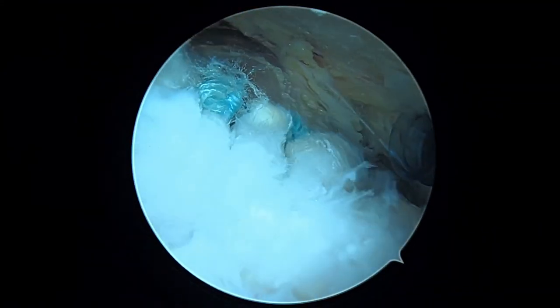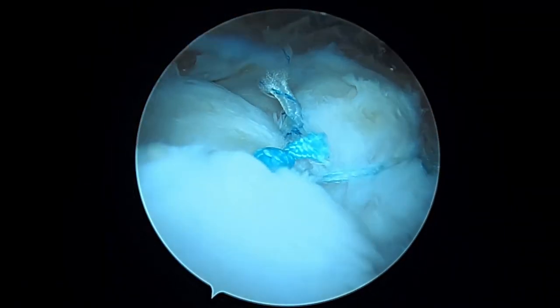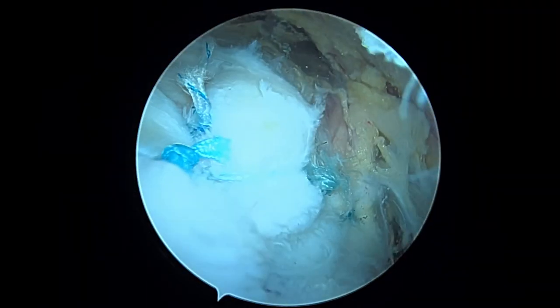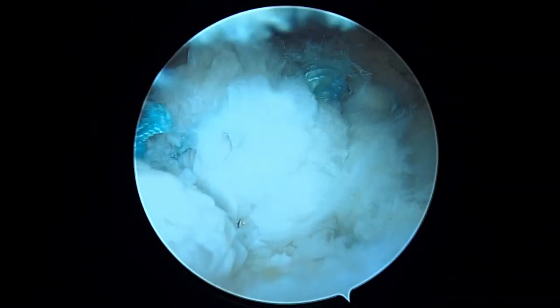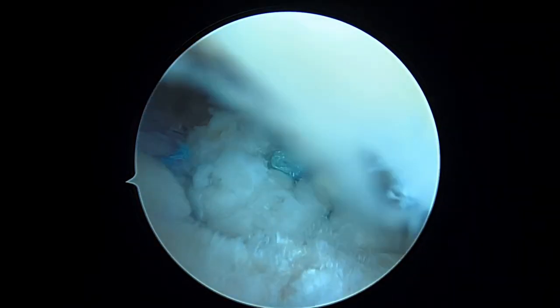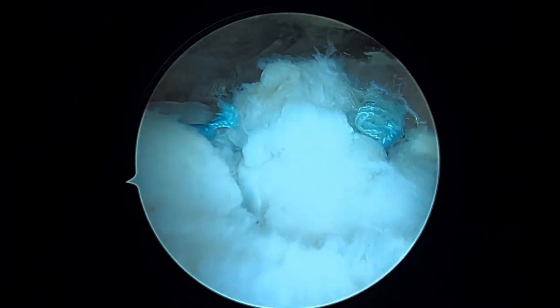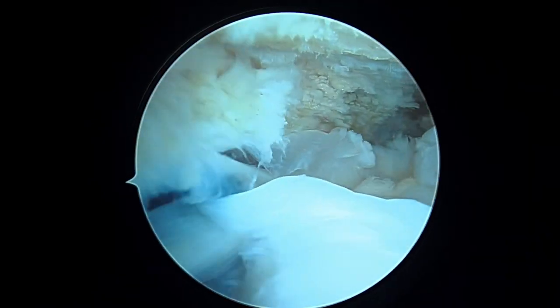We're done. We've got three sutures passed in the back — you can see them on screen. As I rotate your shoulder, the tendon and muscle move together as a unit — that looks good. Rotating the camera forward, we can see the other triple-loaded anchor with all sutures tied, including the rip stop stitch going sideways that got rid of the L-shaped split in the tendon. The biceps tendon is now completely covered up. As I abduct and continue to rotate, I'm happy with how that looks. There's our decompression — we're going to finish up and get you back to the recovery room.